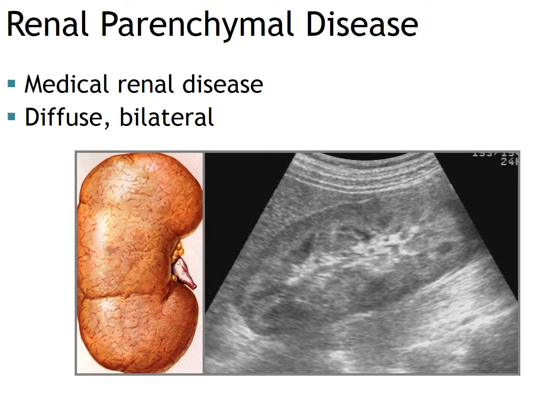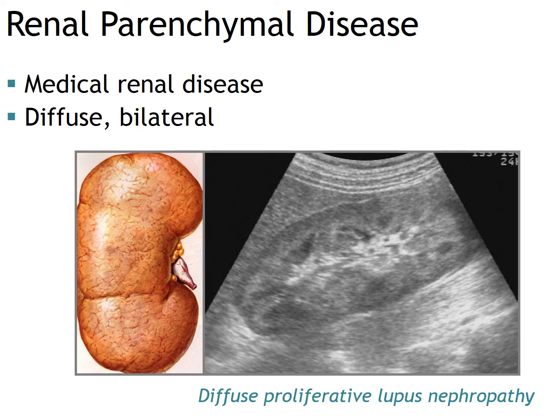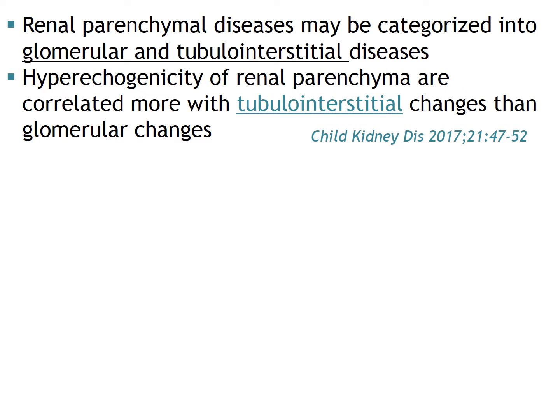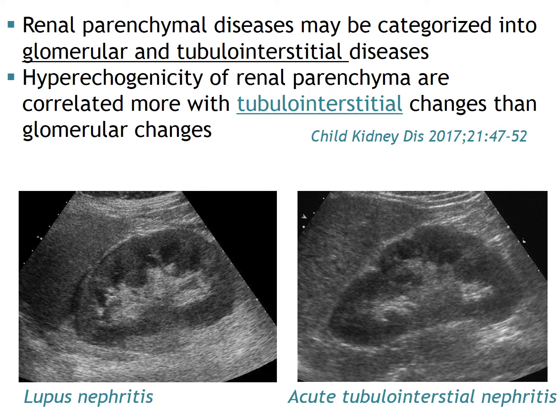Renal parenchymal disease, also called medical renal disease, is usually diffuse and bilateral. This is a case of diffuse proliferative lupus nephropathy showing diffusely abnormal renal cortical echogenicity. Renal parenchymal disease may be categorized mainly into two types: glomerular and tubular interstitial diseases. Hyperechogenicity of renal parenchyma is known to correlate more with tubular interstitial changes than glomerular changes. However, in practice, it is difficult to differentiate these two types based on changes in renal parenchymal echogenicity.